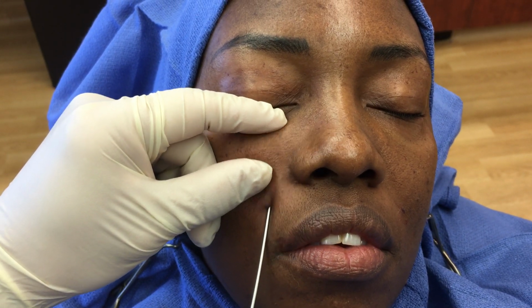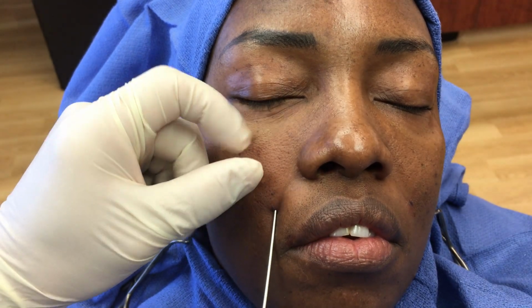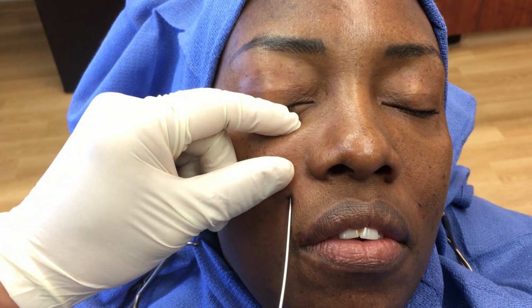We've already numbed up her face, so she really shouldn't feel this. Is that hurting you? Good.